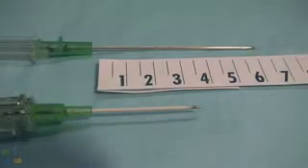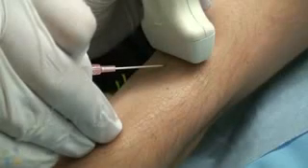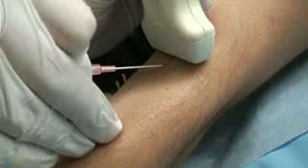The length of standard IV catheters is about 3 centimeters. Longer catheters are available and are recommended for cannulation of deeper veins. In very deep veins, the Seldinger technique with catheter placement over a guide wire may be necessary to secure IV placement. With your catheter in your dominant hand and your non-dominant hand on the probe, approach the vessel at a steeper angle than for a normal IV start. An angle of 45 degrees is usually appropriate.